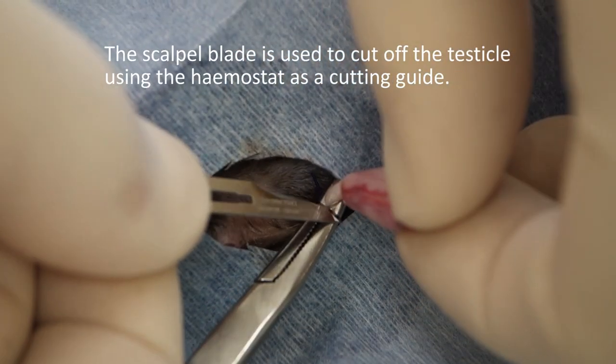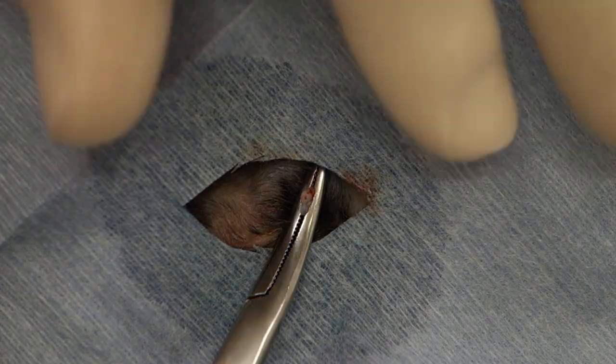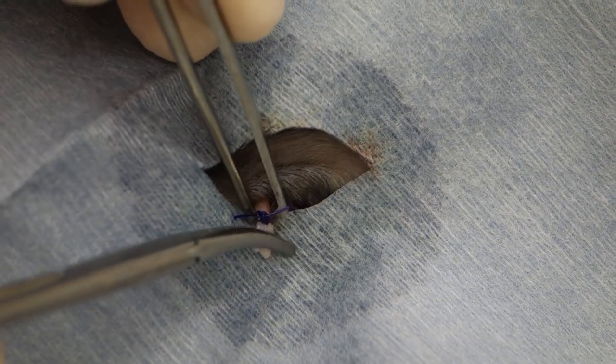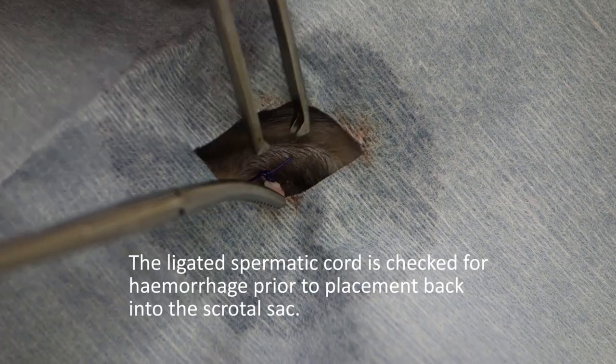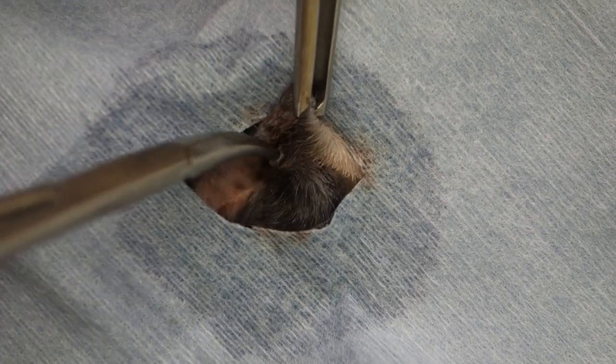We cut across the top of the haemostat to remove the actual testicle. We check for hemorrhage from the ligated spermatic cord, and then tuck it back into the scrotum.